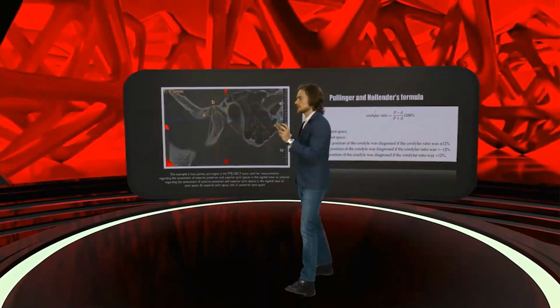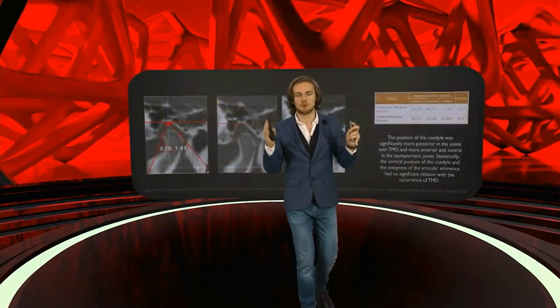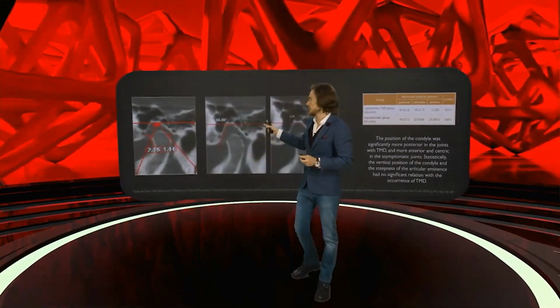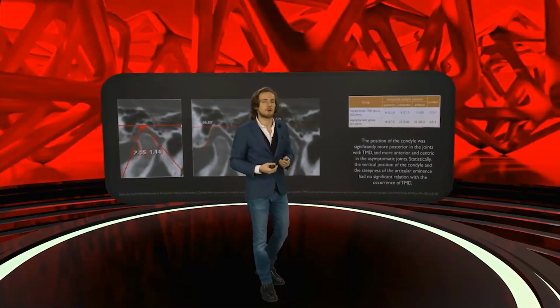So we, the dentists, we really love symmetry. So we are trying to figure out what's the ideal position of the condyle in the fossa according to the measurements. We love maths. We love numbers. We love zero-point dentistry. So we are trying to make the ideal position of the condyle to make sure that we do our best. I'm telling you that the symmetry is not that important unless the condyle is far away from the central position.